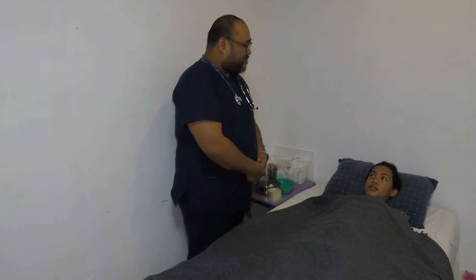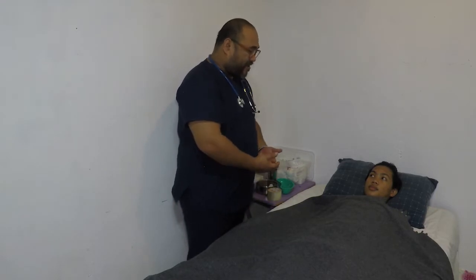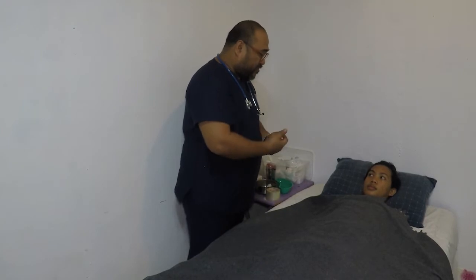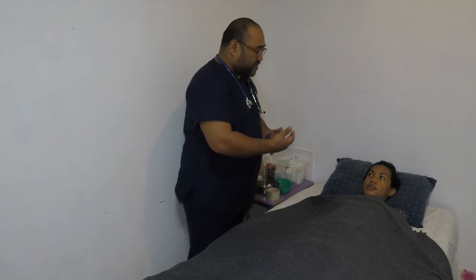So first, you have to check the doctor's order for insertion of the nasogastric tube. This clarifies the procedure and type of equipment required. Then explain the procedure to the client. Explanation facilitates client cooperation. Hello sir, good morning. My name is Erich and I'll be your caregiver. We'll be doing the insertion of the gastric tube on your nose so that we can feed you properly, because we know that you have a difficulty in eating solid food.